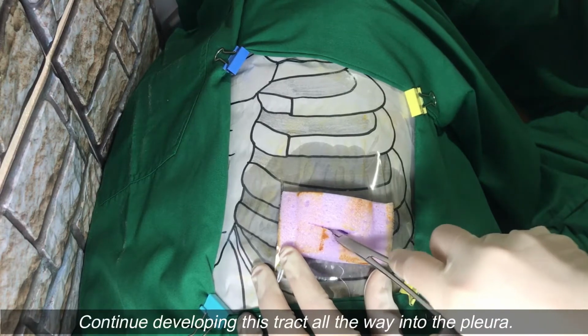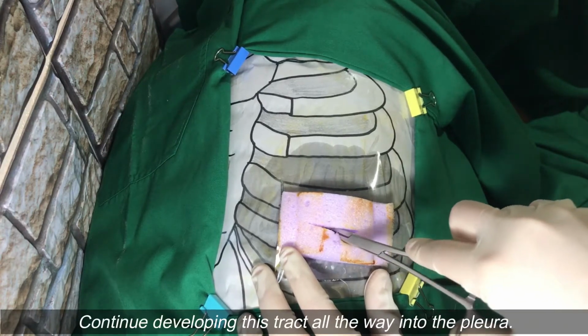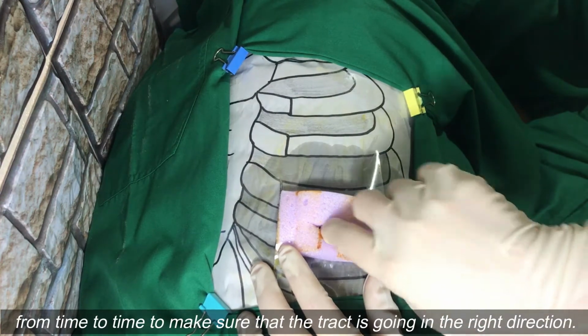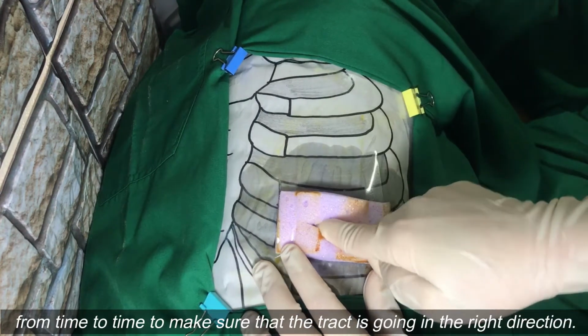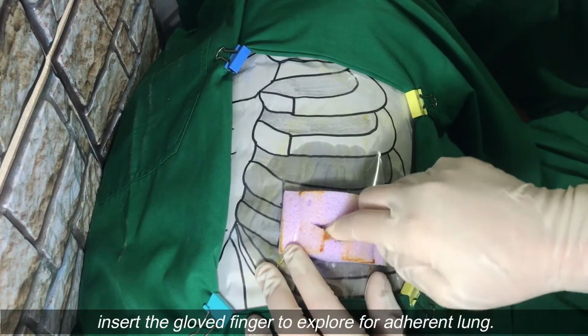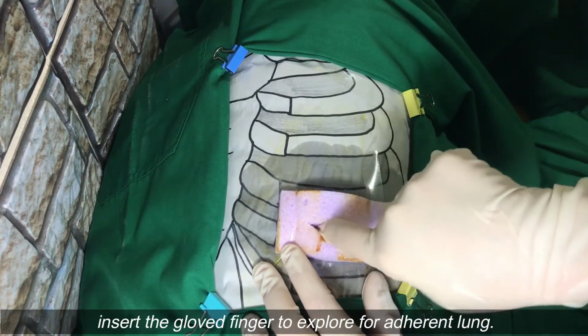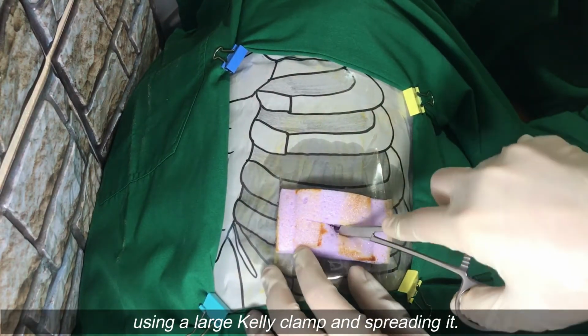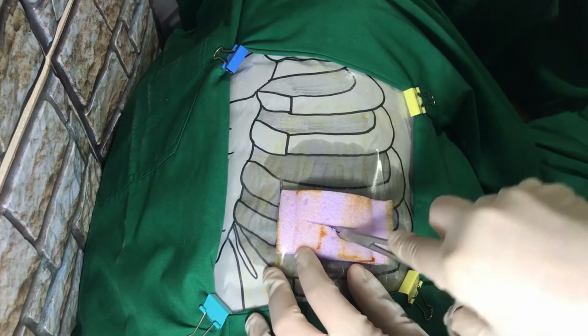Continue developing this tract all the way into the pleura. Remove the clamp and explore the tract with a gloved finger from time to time to make sure that the tract is going in the right direction. After the pleural cavity has been entered, insert the gloved finger to explore for adherent lung. Further enlarge the opening in the pleura using a large Kelly clamp and spreading it.